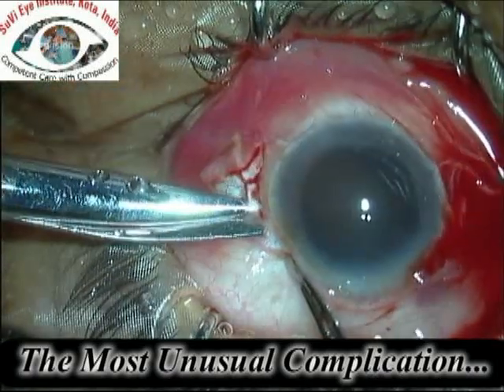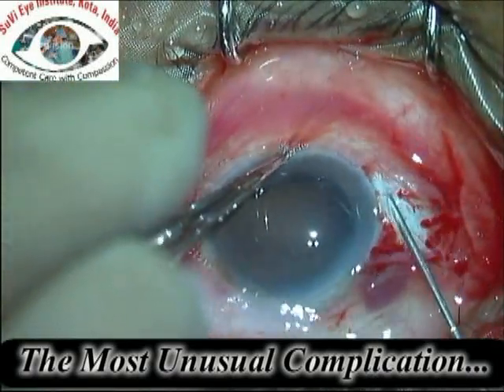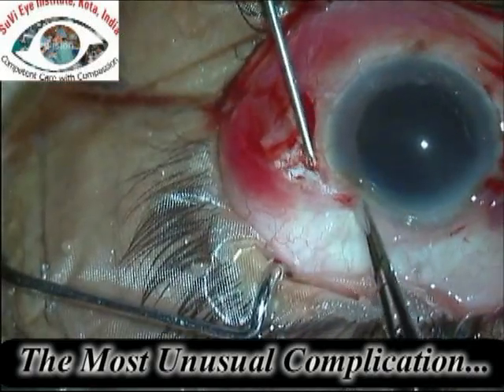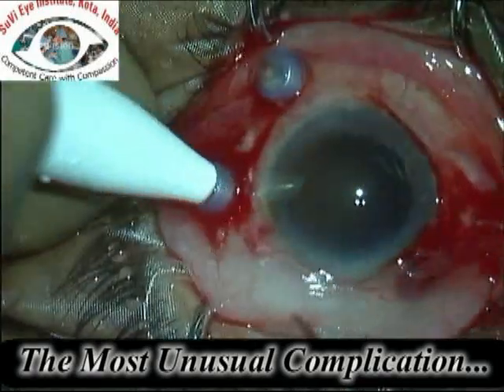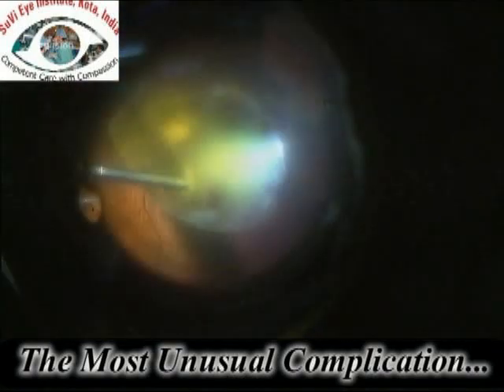The retinal surgeon came over and managed the case. This is a scleral tunnel being made in anticipation of a scleral glued IOL. After making the scleral tunnel and preparing it for the glued IOL, the trocar is used for making scleral ports.